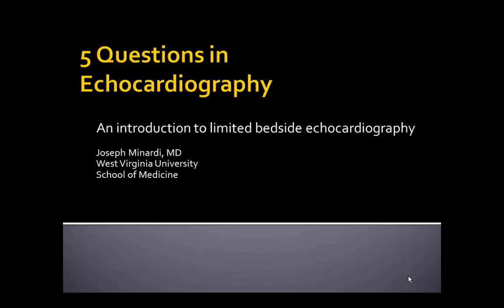So you'll always hear people like me saying, take a better history, do a better physical. And another thing you'll hear me say is, use ultrasound and echo when we're talking about the heart. Ultrasound is a relatively cheap, relatively easy, incredibly safe, very effective way to give you extra information to help you take better care of your patients.